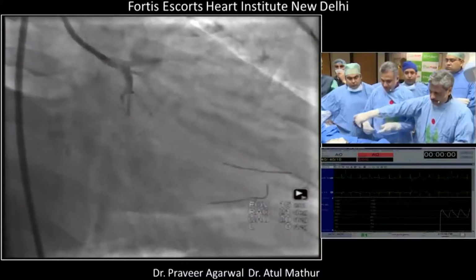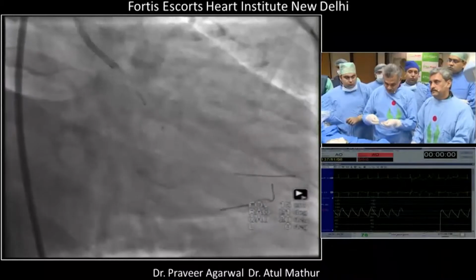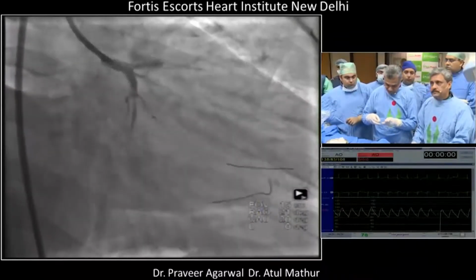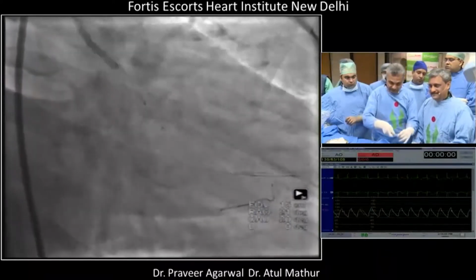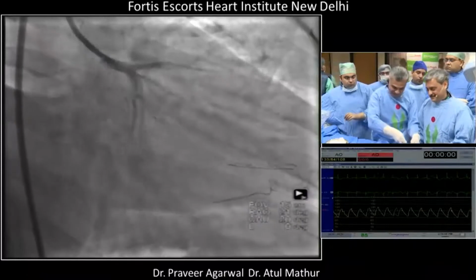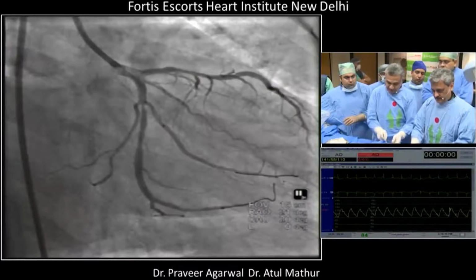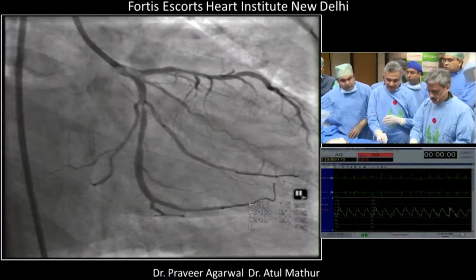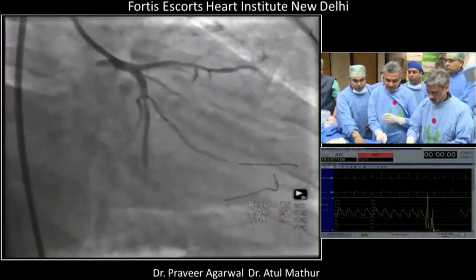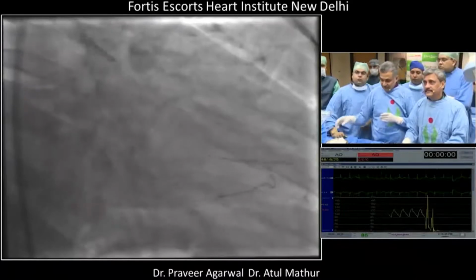And how many of you would like to have a cutting balloon after this dilatation? Only one person. I don't do cutting balloon because it's very expensive for us. I can get another stent for the same price. If IVUS shows fibrotic tissue, then I would go for it, if expense is not a problem. Yeah, if IVUS shows it's a fibrotic lesion, then we can use cutting balloon. I think we'll take an IVUS. Fine, then we'll take an IVUS.